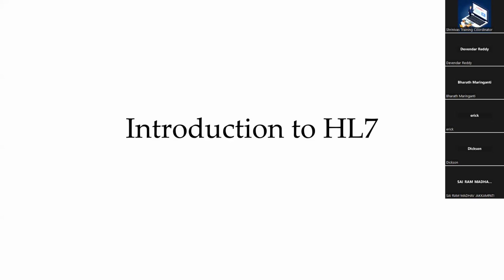And then from there on, we can pick it up further about certification, and we'll touch base on a few certification related topics, and then we will conclude our training. Okay, so that would be the parts of the training. Today we will go through the introduction of HL7. So we will just begin with the first session. We'll take a look at the basic stuff, what is needed for us to progress more in terms of HL7.